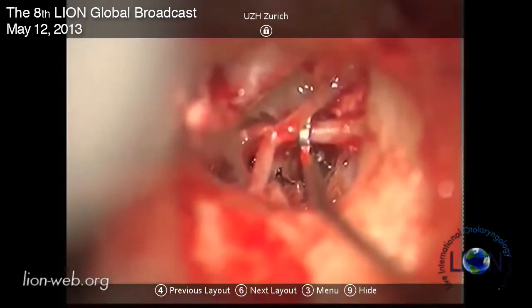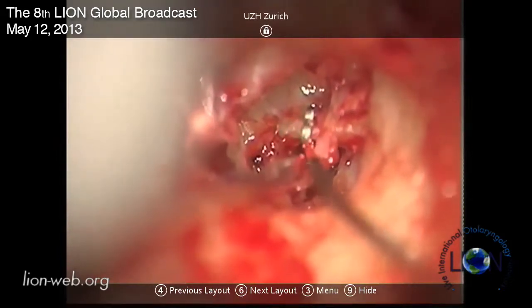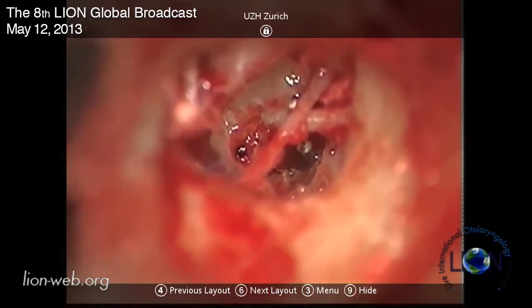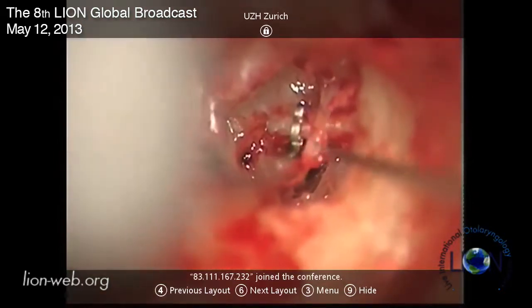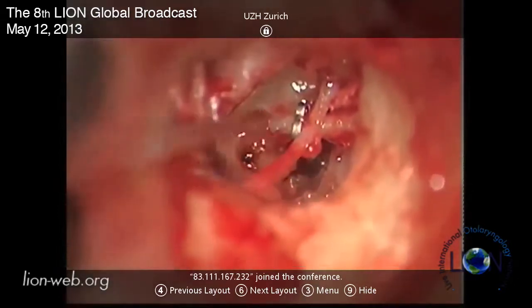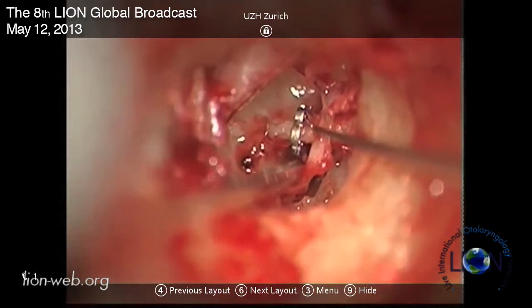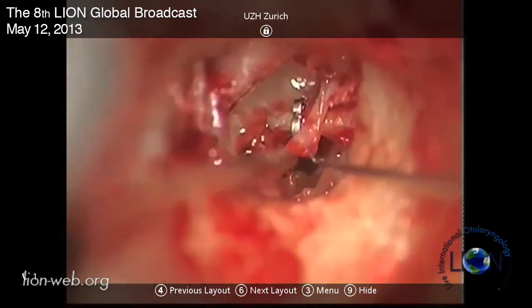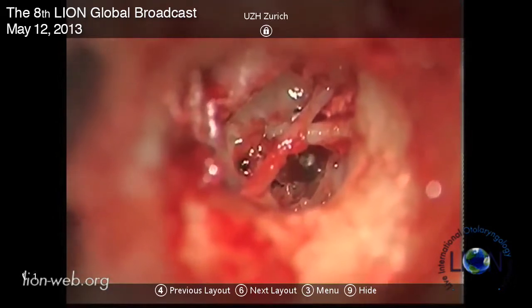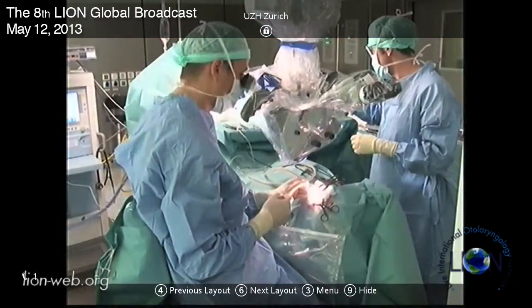One, two, three - it looks fine. Now you can see the prosthesis is fixed. This looks like a perfect fit, and it is nicely in the stapedotomy.